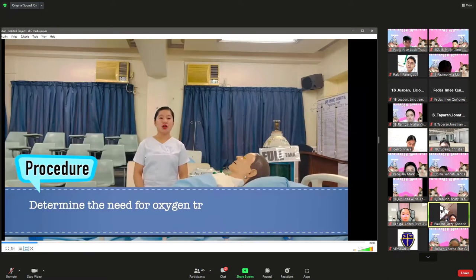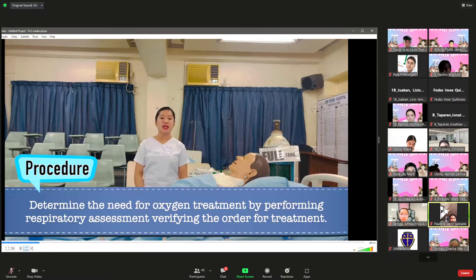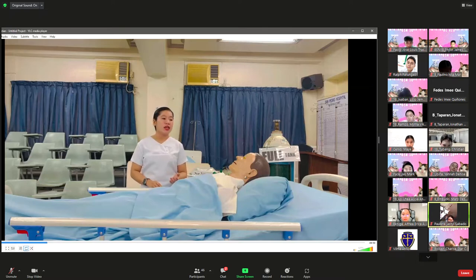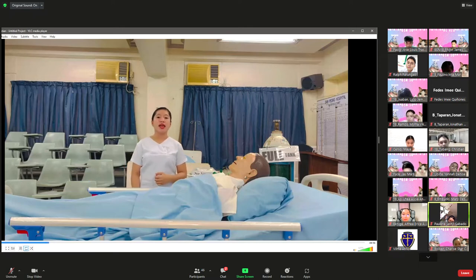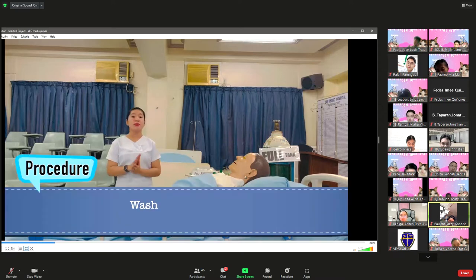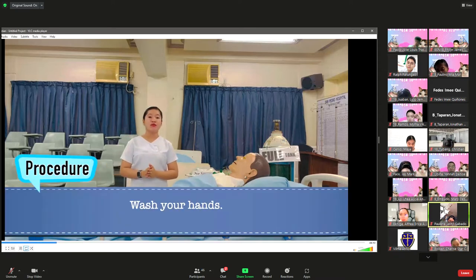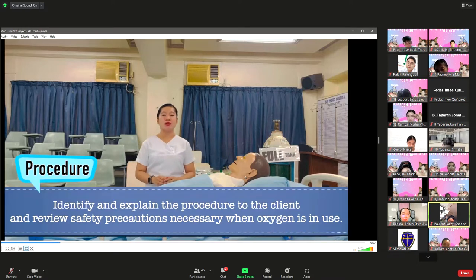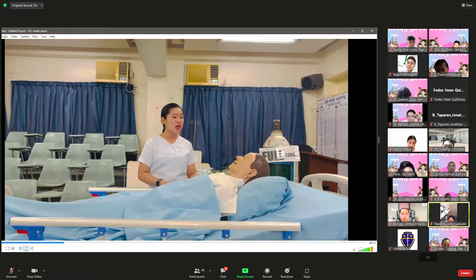First, determine the need for oxygen treatment by performing a respiratory assessment and verifying the physician's order. You can perform vital signs and, if available, use a portable pulse oximeter to obtain the patient's oxygen saturation, providing baseline data and ensuring the most appropriate device is selected. Next, perform medical hand washing to deter the spread of microorganisms.